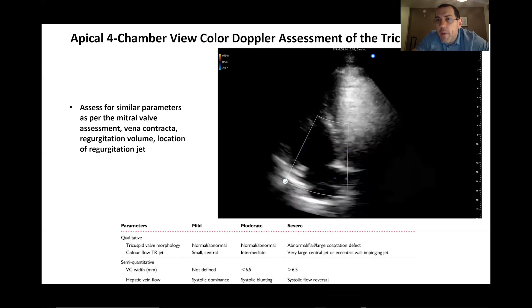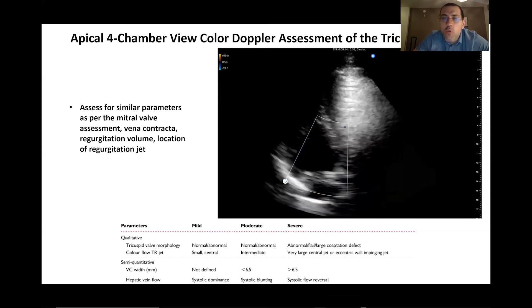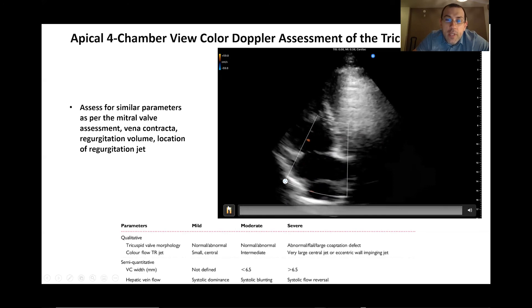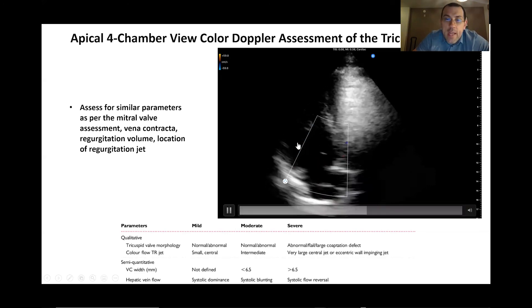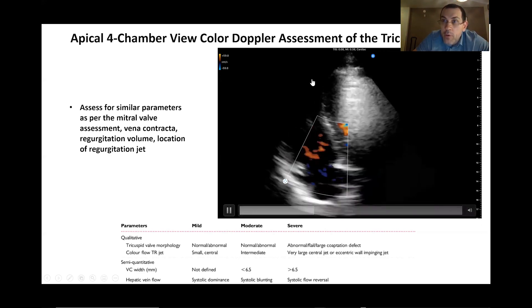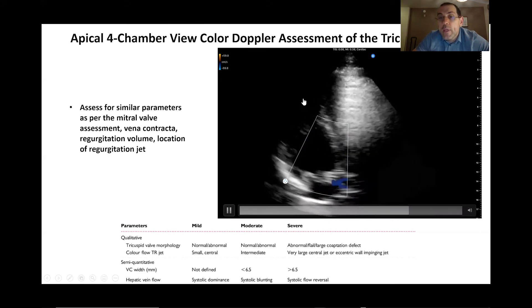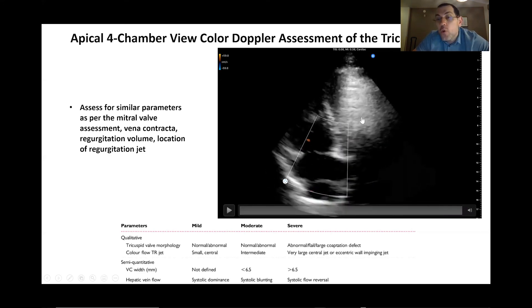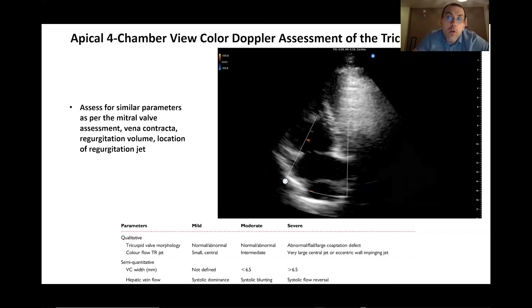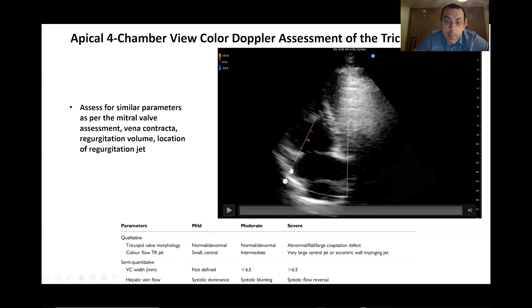One more popular measurement is TAPSE — tricuspid annular plane systolic excursion — which looks at how much the tricuspid annulus moves up and down. Similarly, on the left side we can measure MAPSE — mitral annular plane systolic excursion — by assessing the mitral annulus movement. For details on obtaining those values, please see our other videos on those topics.